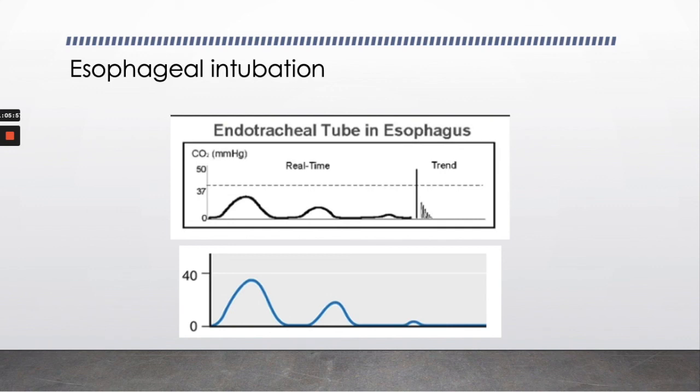All right, so last but not least, intubating the esophagus inadvertently. When we intubate the esophagus inadvertently, we see this big carbon dioxide.